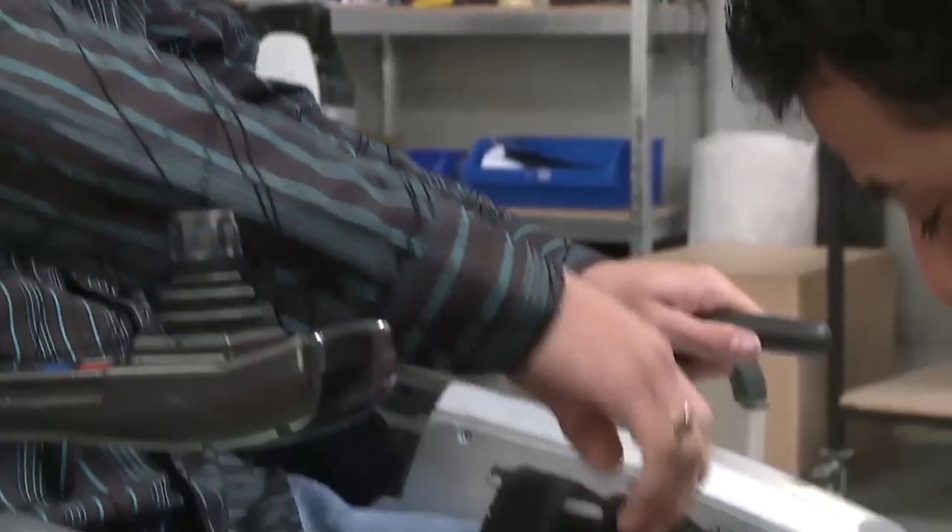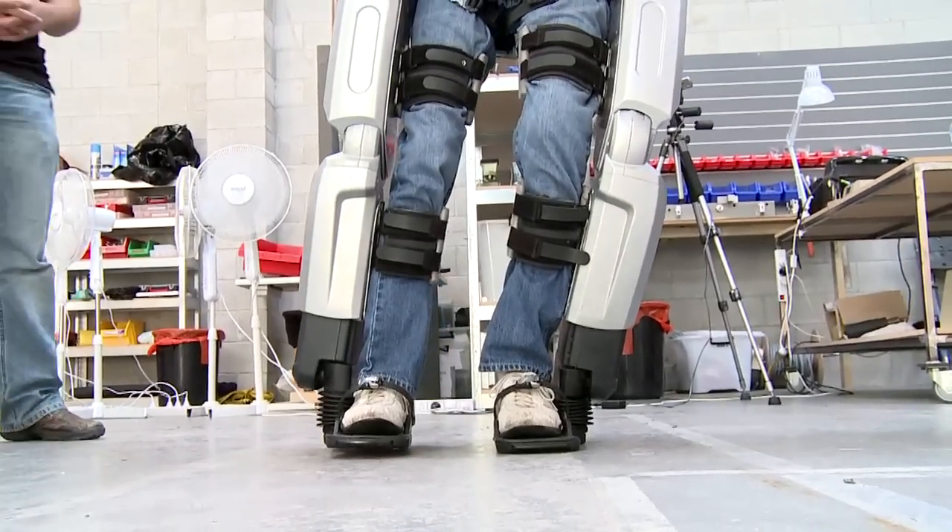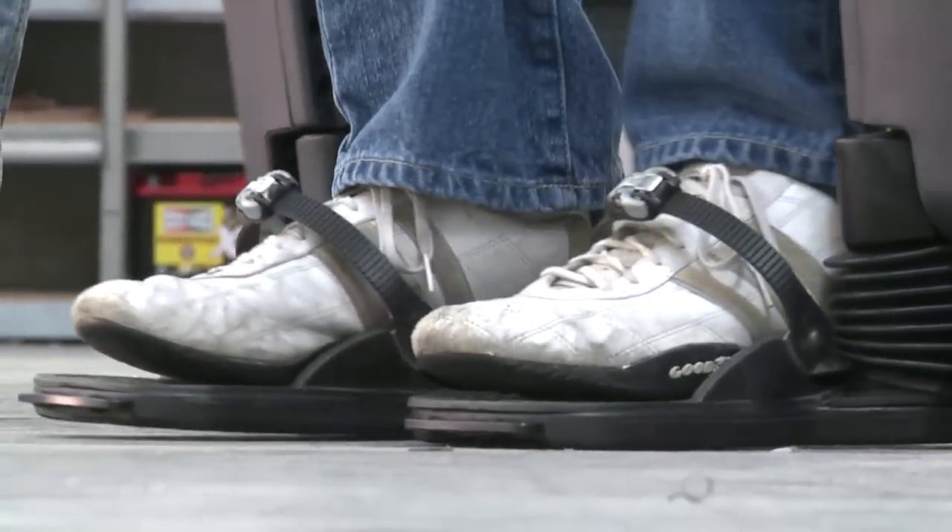Once you understand the movement of the machine — understanding what action is happening in that step first, like knowing to lean to the left before that leg lifts off — once you're used to all that and realize what's actually happening, it's really easy to get used to.